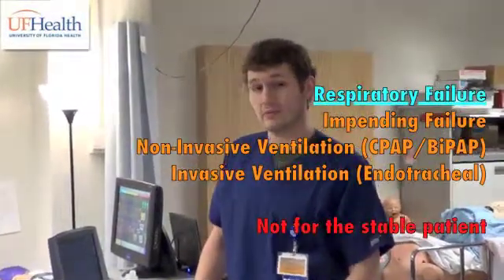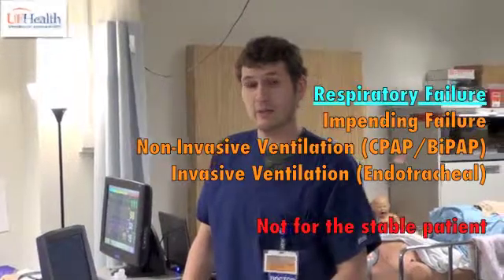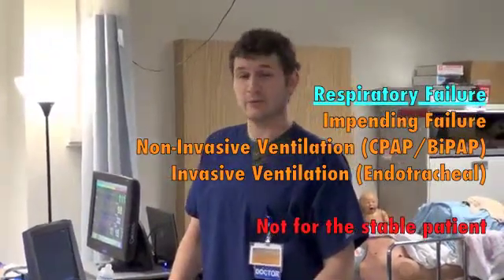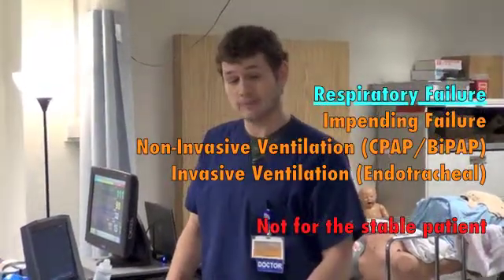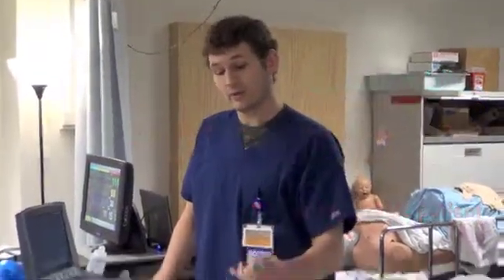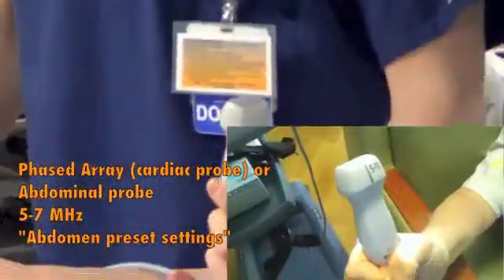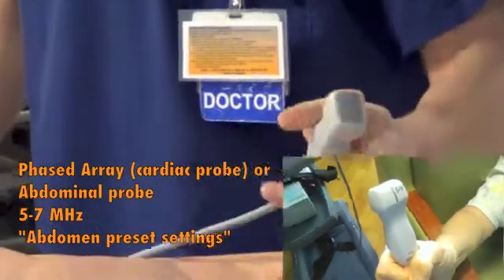The patient population we're most concerned about are patients in the emergency department or ICU settings who have respiratory distress and are either recently put on CPAP or BiPAP. The probe used for this exam is ideally a cardiac probe, but a transabdominal probe can be used as well.